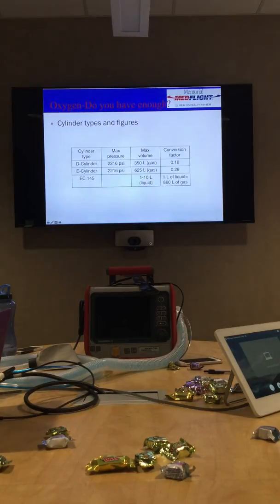All right. So I threw this up there because of the test. How do you know? I've been on that transport before where you're like, gosh, do we have enough oxygen? Are we going to run out? Do we need to take an extra D-tank? Because I know I've been on transport where we've taken extra.